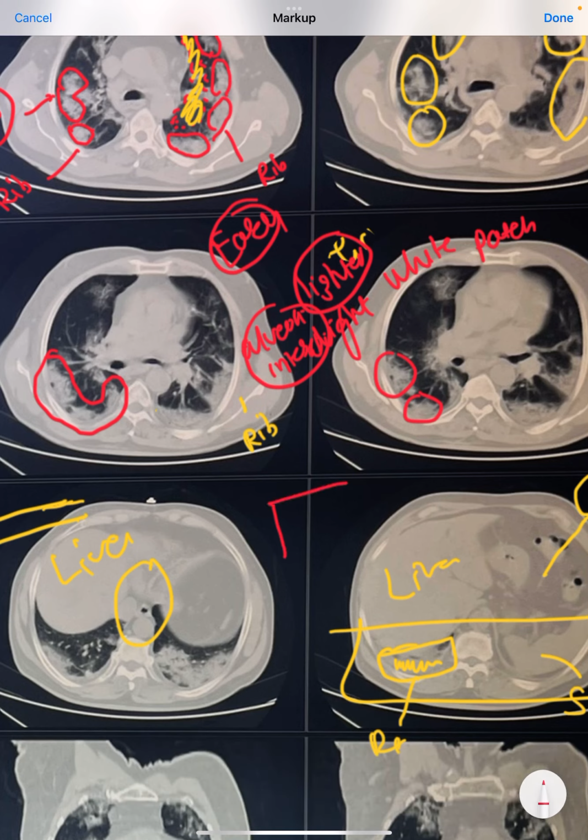You can simply understand ground glass opacities like this: if you rub a mirror or a glass with a firm thing like a stone, you get a pattern, and that pattern is called ground glass opacities.